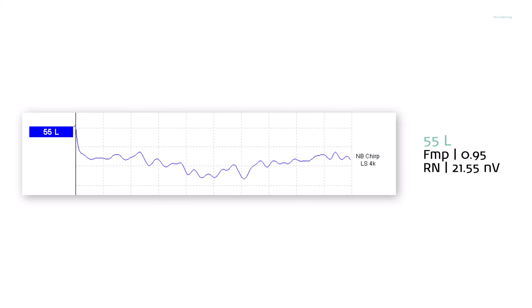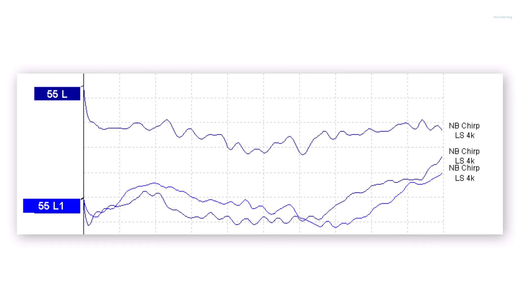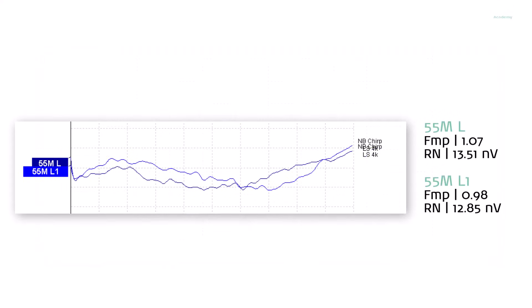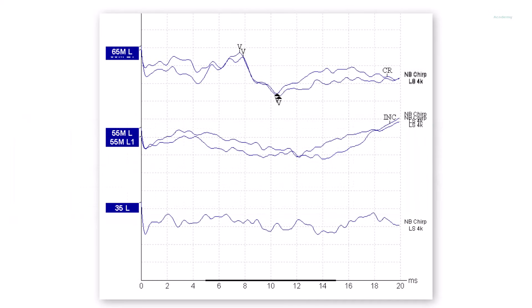The next step was to focus on the level of 55 dB. One waveform was recorded here during the initial phase, however the residual noise of this waveform is too high to contribute to a true response absent. However, it might be possible to use this waveform if we need to run more than two traces — the first waveform could be combined with the third to elicit a residual noise that satisfies RA criteria. The two new waveforms did not satisfy RA criteria, therefore an additional waveform was run, giving four waveforms at 55 dB in total. By combining the first and third, and the second and fourth, residual noise levels of 13 and 12 nanovolts were achieved — below the 15 nanovolts required to satisfy RA criteria. Unfortunately, despite these low residual noise levels, there was still too much noise between the two final waveforms to meet RA, so the level of 55 dB had to be categorized as inconclusive.